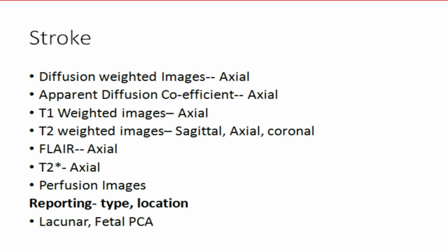And I do have some examples. Again, T2 star to make sure if there is a hemorrhagic component in the stroke or there was an old hemorrhage. I know as the TPA, or the medicine for acute stroke patients, is approved, I really hope in the next 3 to 5 years you're going to see way more stroke patients in the acute phase than right now. So we need T2 star images in those cases, because if there's a hemorrhage already, these patients are not candidates for TPA. And this should be done, there's a window, so we need to do it as soon as possible.